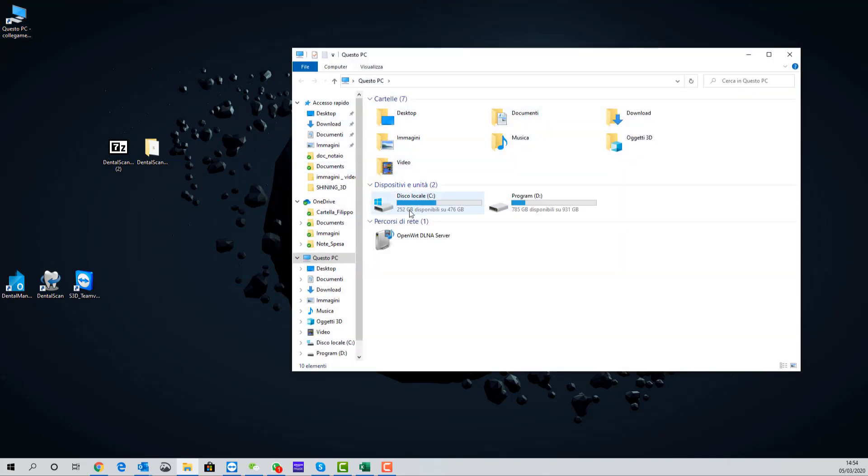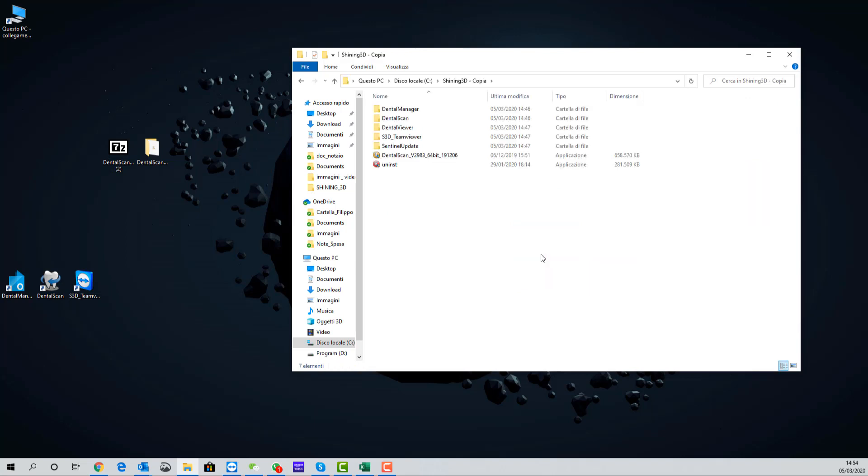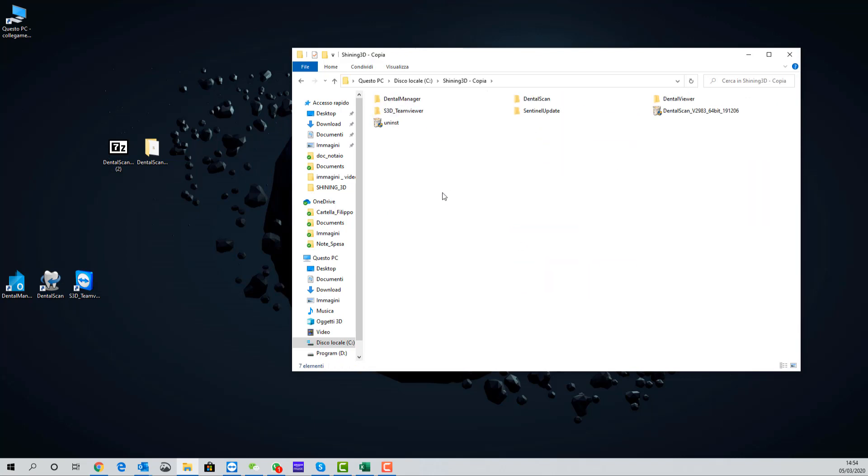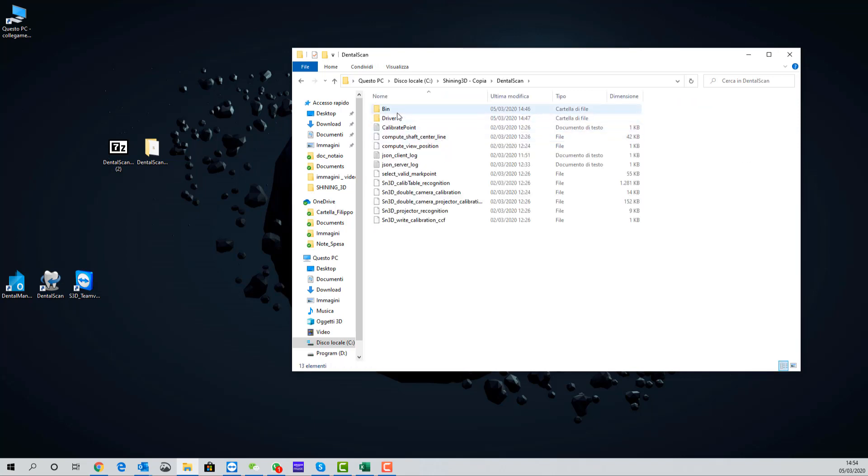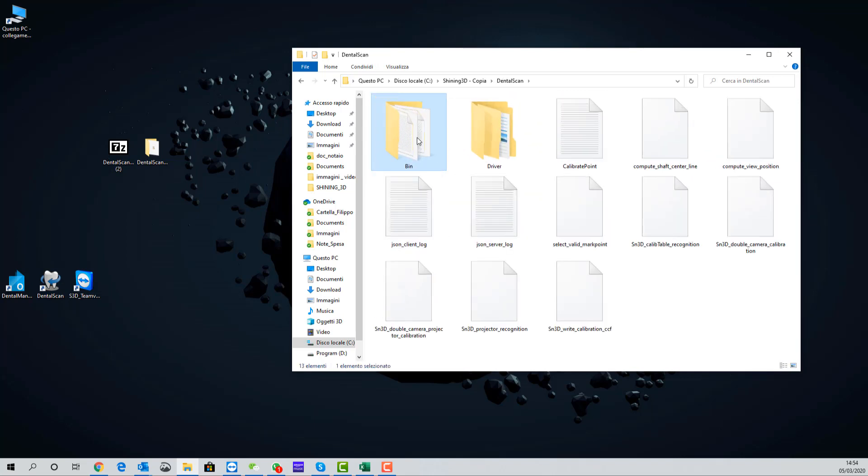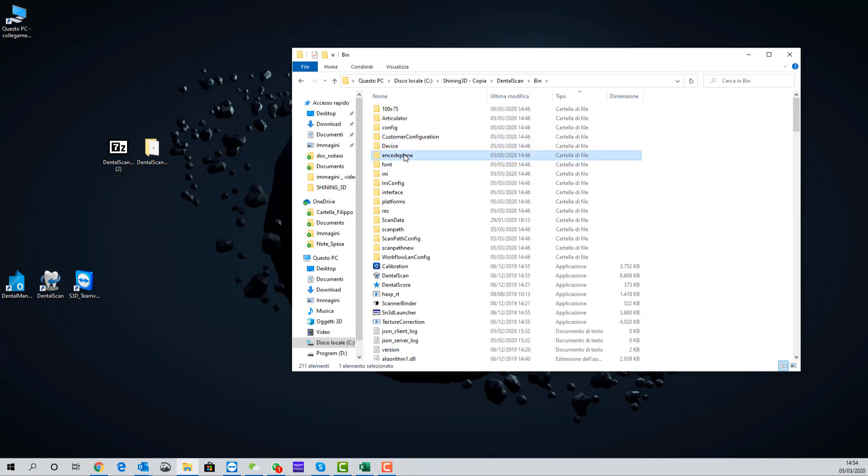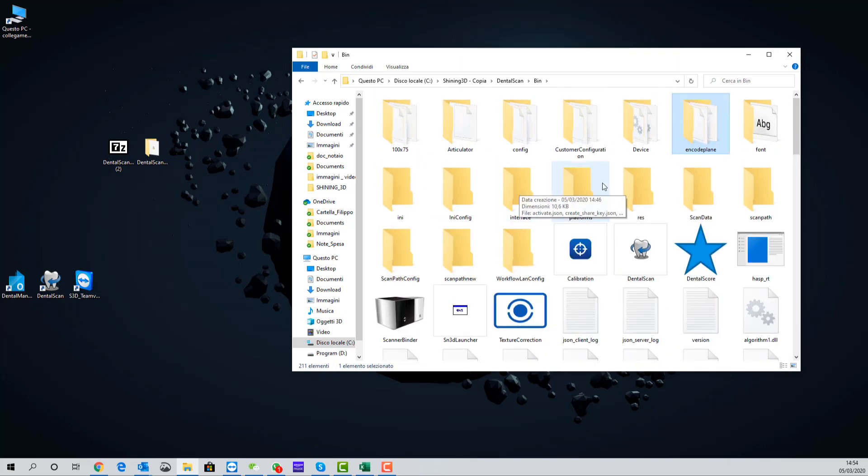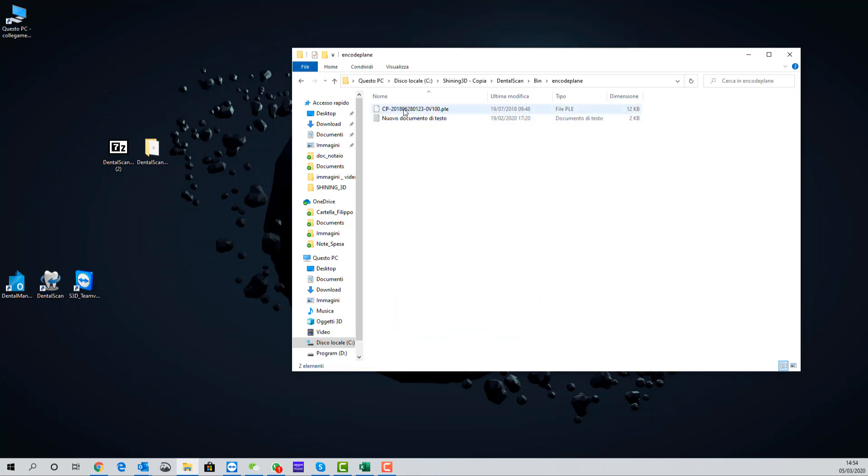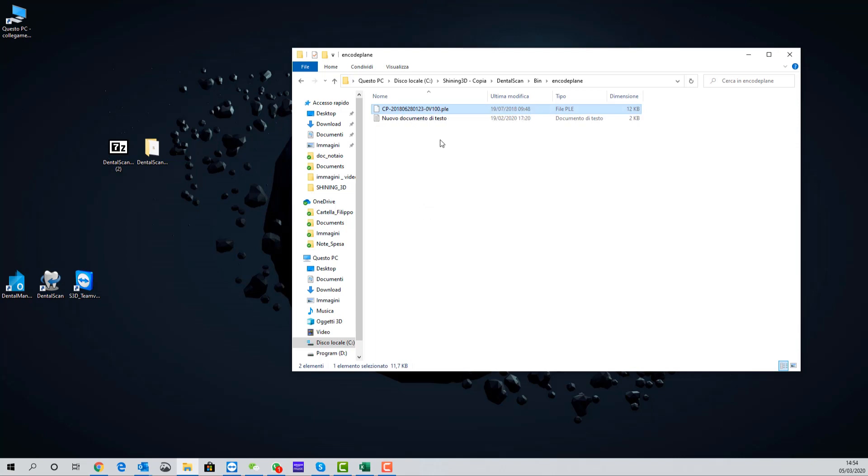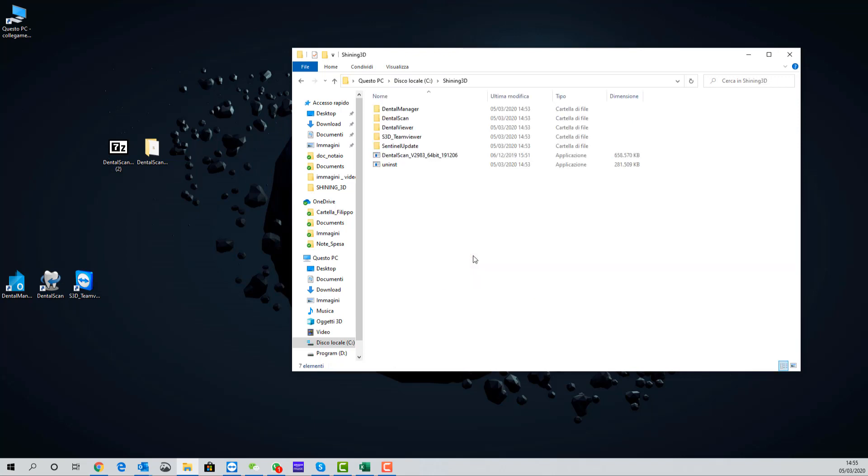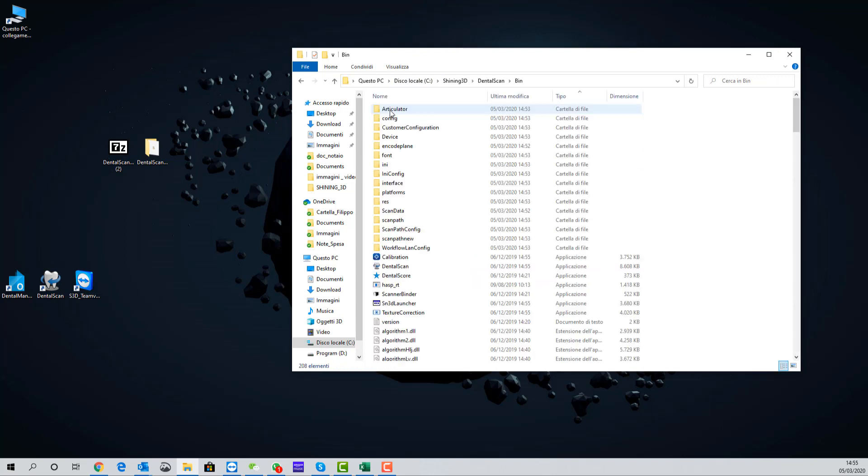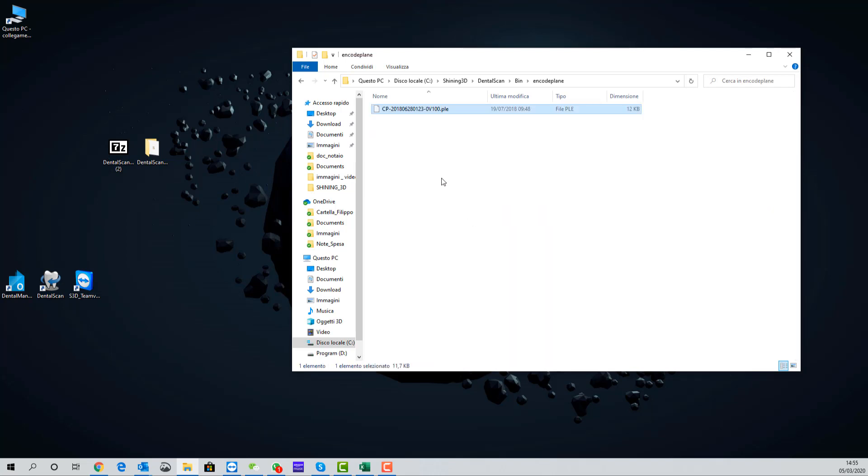Now we can go in our C drive, open the Shining3D copy folder. Then enter dental scan folder, then bin, then encode plane. In the encode plane folder we have the file related to the calibration plate. We need to copy this file and paste the file in Shining3D dental scan bin encode plane. This is the folder where it's mandatory to have the calibration plate file.